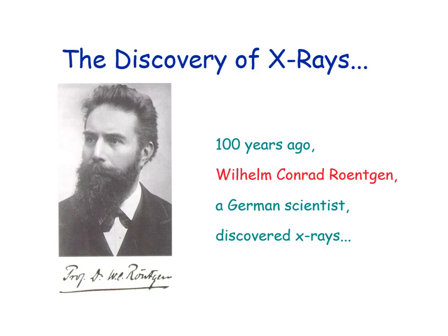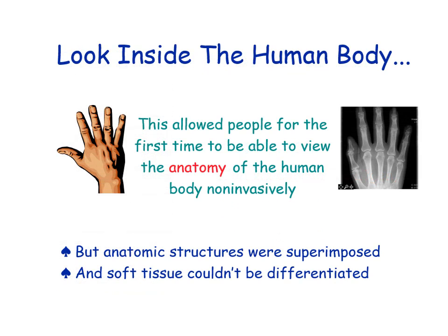The discovery of X-rays. But anatomic structures were superimposed, and soft tissue couldn't be differentiated. Look inside the human body. This allowed people for the first time to be able to view the anatomy of the human body non-invasively.